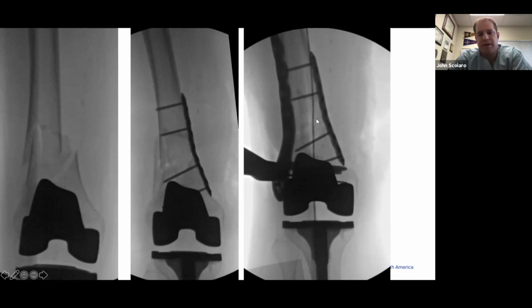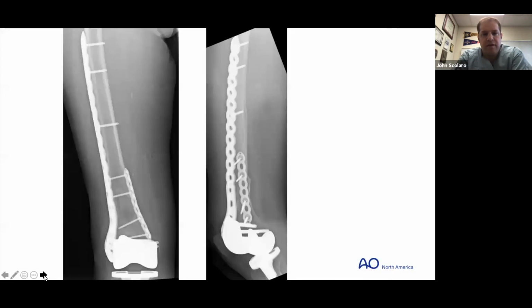That's what we're doing here on the right hand side. And I'm just making sure that my axis from the center of the femoral head, down through the knee, down to the center portion of the tibial plafond is somewhat centered over the knee. Because if you go to the final images, that doesn't necessarily look right. It looks like that fixation is in a tremendous amount of valgus, and the rotation affects that. A cone down image from your image intensifier affects your ability to judge that. So use some sort of external guide to try to make sure you're aligning these correctly.